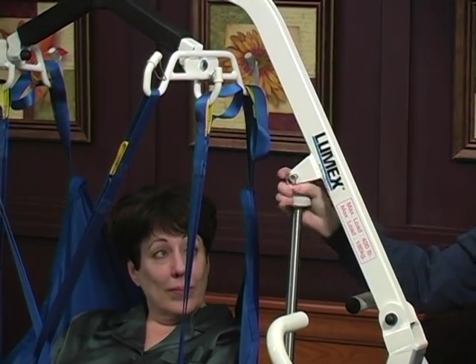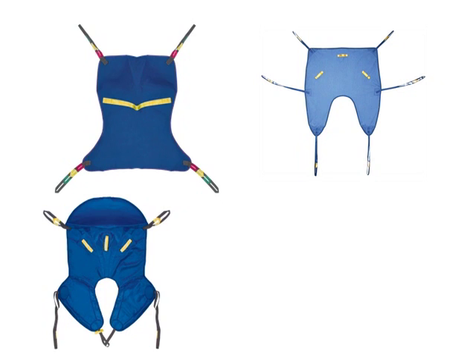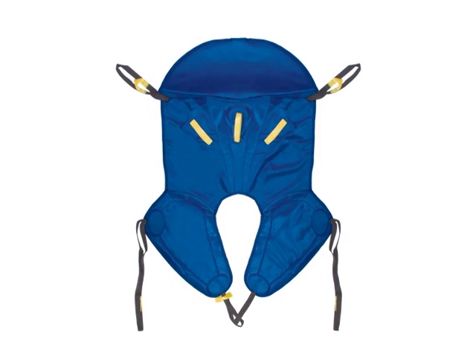Sling Selection: When choosing the proper sling, consider the type of transfer, resident weight and abilities, height, and the most comfortable sling for the individual. There are full body slings, universal slings, divided leg slings, and toileting slings. Slings are available in solid fabric or mesh for quick drying; mesh slings are generally used for bathing. There are also padded and non-padded varieties, those with headrests and those without. If a resident will be in a sling for a period of time or has skin conditions, the use of padded slings is recommended.